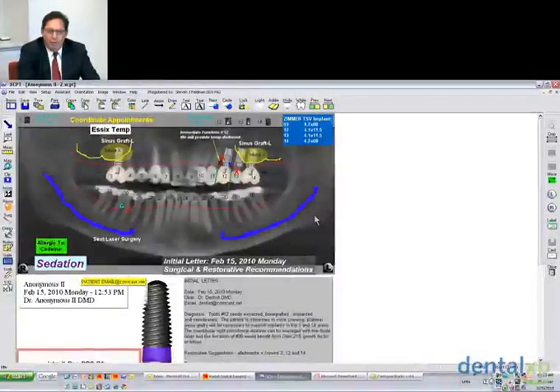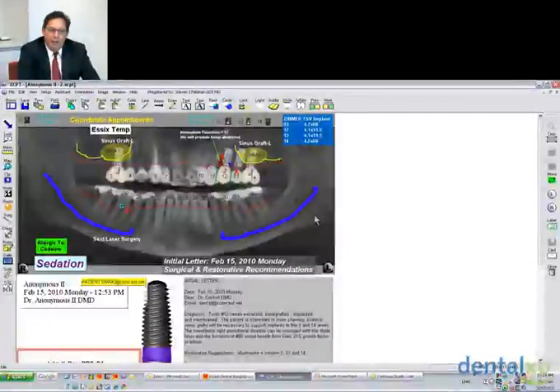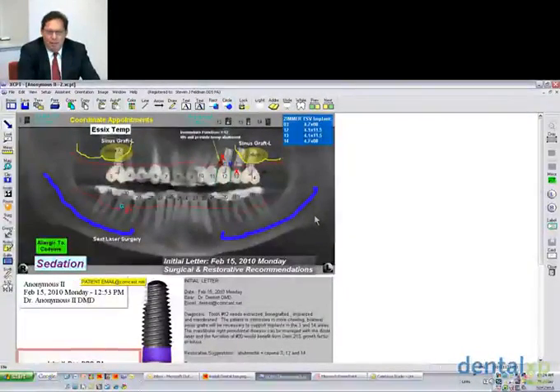To me, that wasn't a very difficult decision to make, and it wasn't the only reason for a CT, because dentistry is asymptomatic and subclinical, and mostly what's wrong, we're not going to know until it's too late. I wanted to find out what else was going on in all the rest of their teeth, and it was my desire, as they do in medicine, to give patients clean bills of health where they were clinically normal, or at least clinically normal to that date. And I'll define that for you in a moment.